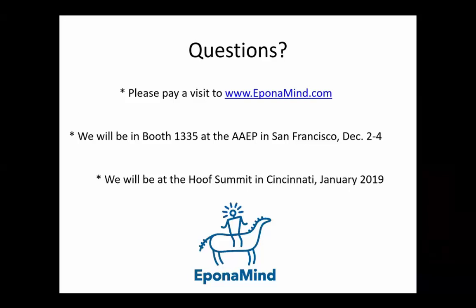Maybe measure it with a ruler and know that, oh, that's 2.25 inches. Then later in any software system, there should be a way to indicate that that thing was 2.25 inches, and that'll set a scale for the image. So yeah, you can on the fly put your own scale marker in if you need to. We need to get more vets using proper scaling. We're trying to be educational in our efforts and get vets doing this. A lot are now, but there's still a ways to go.